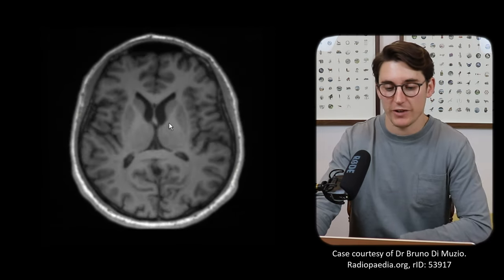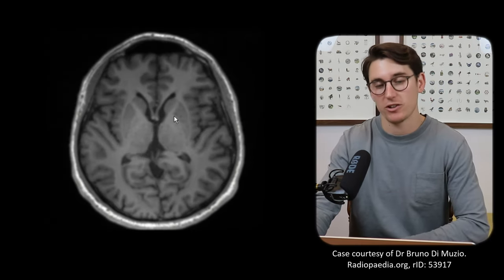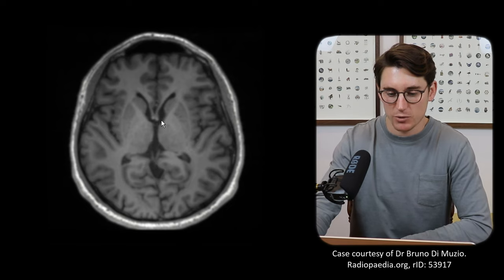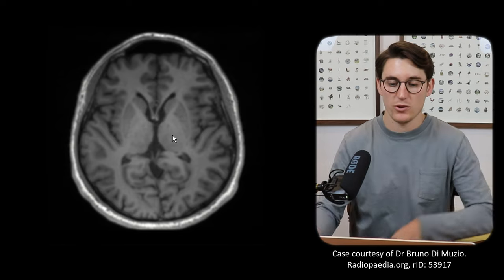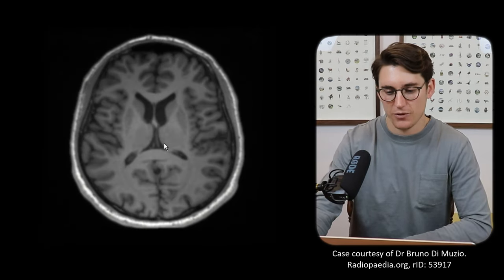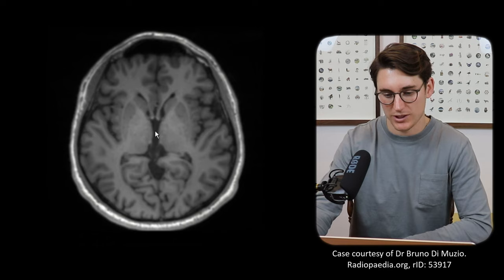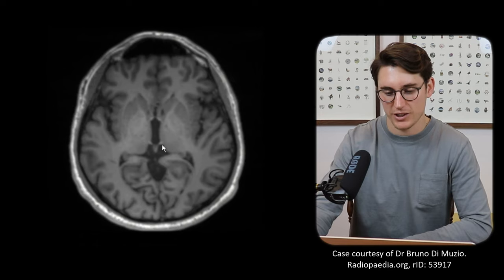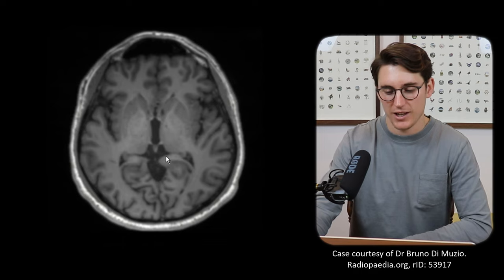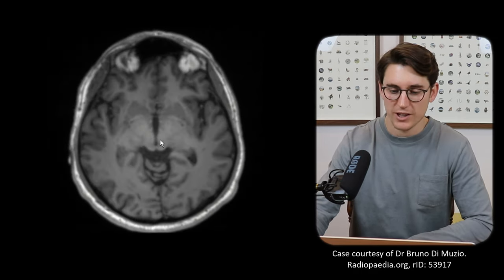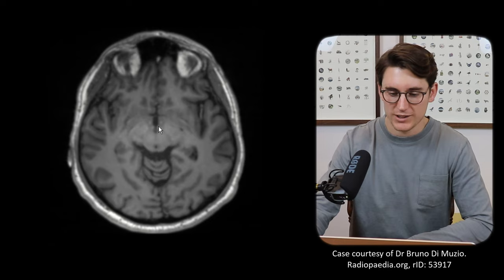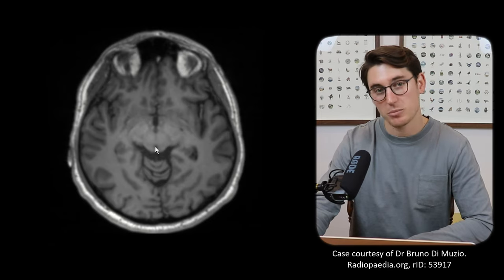So we've looked at our lateral ventricles — let's go have a look at our third ventricle. We can see our interventricular foramen coming down into our third ventricle, flanked by those two thalami. Let's head further down in the scan. We can see we're at the level of our third ventricle — here is our third ventricle, our thalami on the side. Let's follow the third ventricle down; we can see it narrows right down into the cerebral aqueduct.